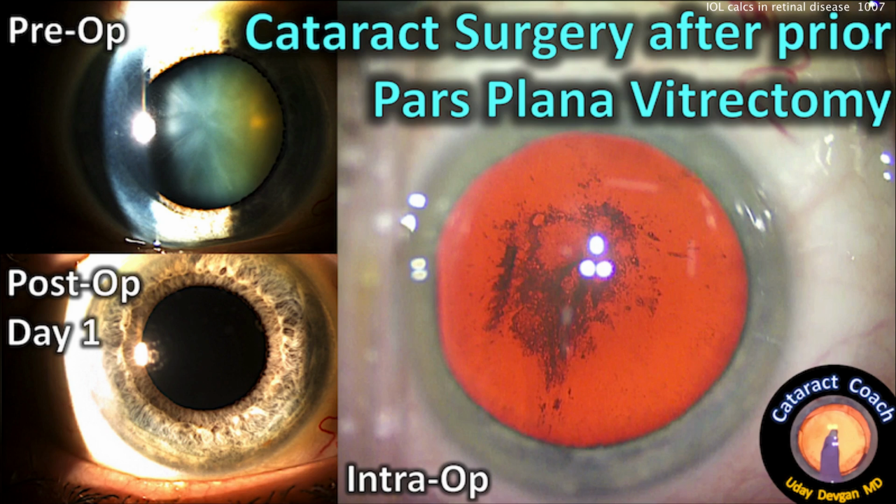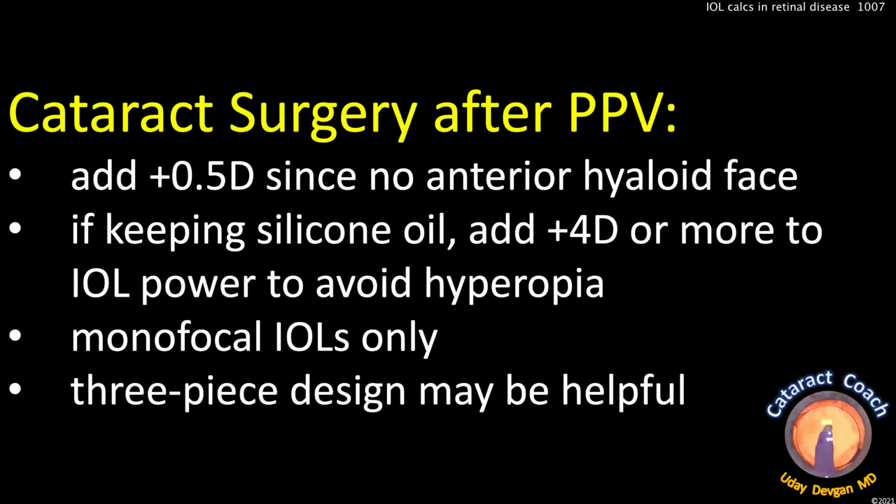After routine pars plana vitrectomy, the patient got a gas bubble or fluid in the eye, but not silicone oil. The lens calculations are relatively routine, but you should still add about a half diopter. So after pars plana vitrectomy, when you're doing cataract surgery, add a half diopter since there's no anterior hyaloid face, and that IOL optic may sit a little more posterior in the eye.